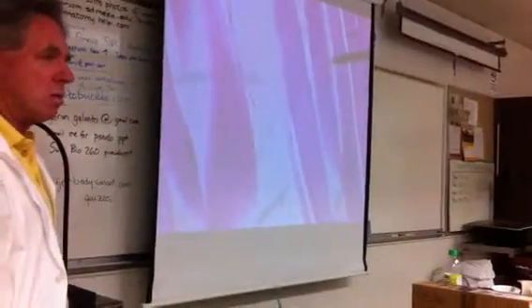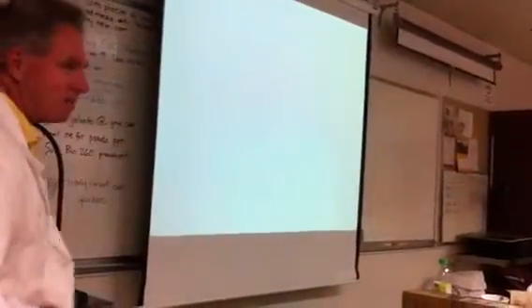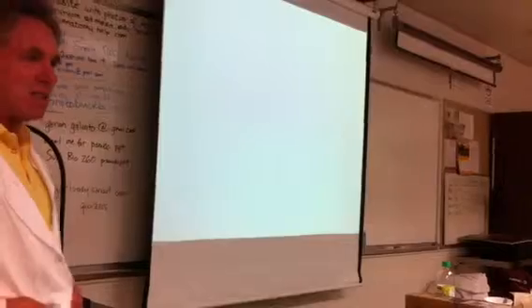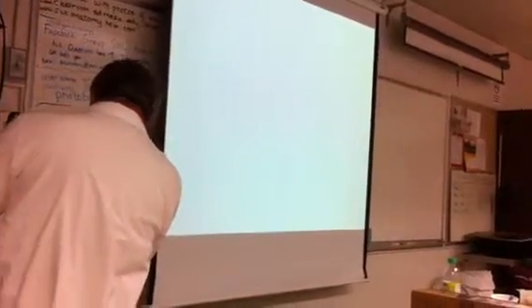So 3 down, 1 more to go, and the last one will be smooth muscle, the muscle found in the hollow organs of our body, the GI tract and things like that. The characteristic here, as sort of the default, is you don't see any intercalated discs. You actually don't see any striations. This is a slide that you saw earlier in the semester.